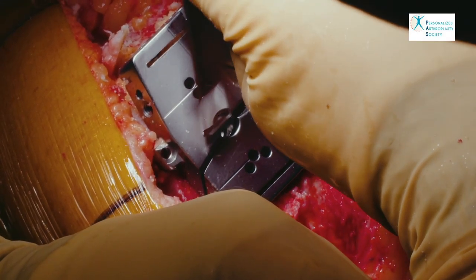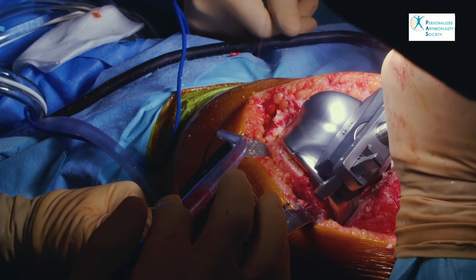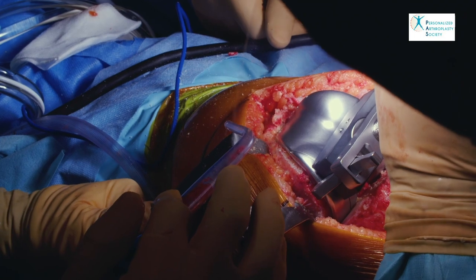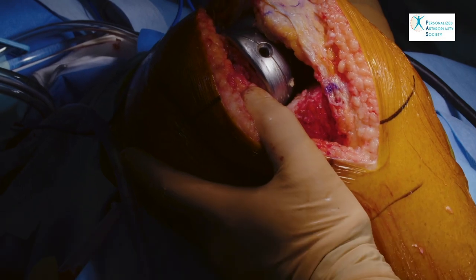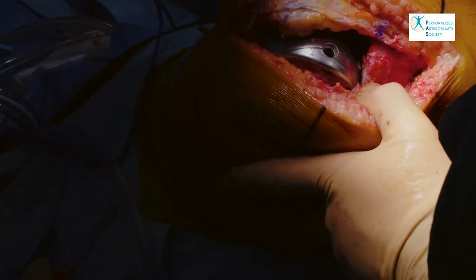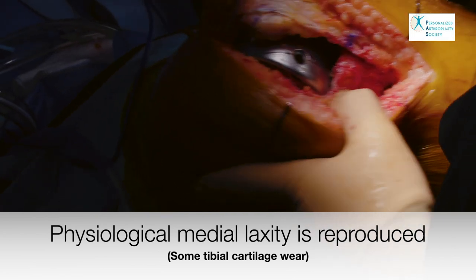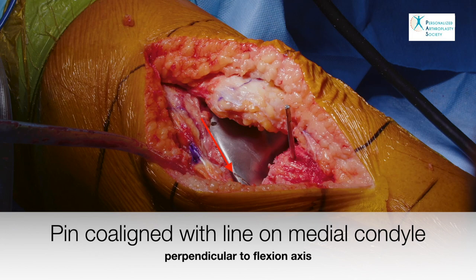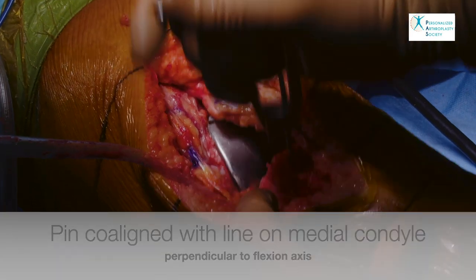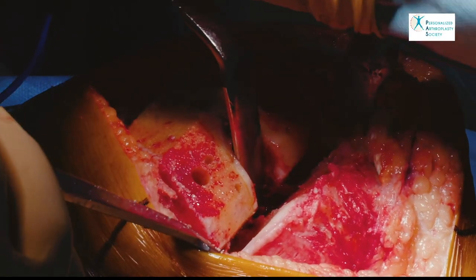We can do this only when the medial-lateral width of the femur permits upsizing the component while avoiding medial-lateral overhang. This is possible in kinematic alignment because KA avoids the typical lateral overstuffing of mechanical alignment, and because in full extension the patella is disengaged from the trochlea. A pin or drill bit parallel to the line of the medial femoral trial component can be inserted in the proximal tibia. This can be useful in cases of severe lateral plateau bone loss when we determine the axis of the tibial cutting plane later on.